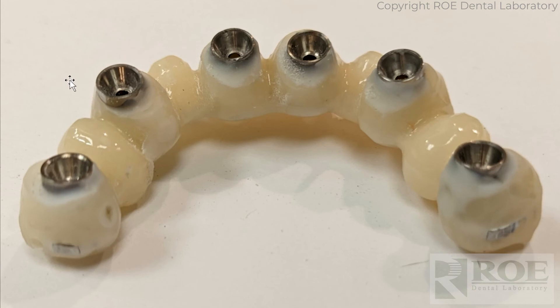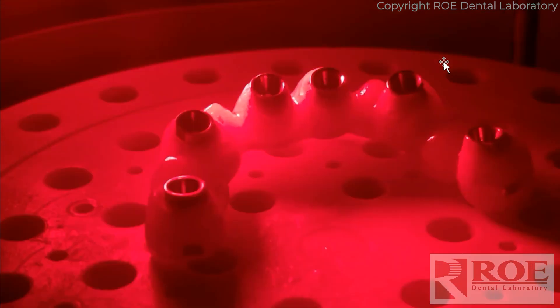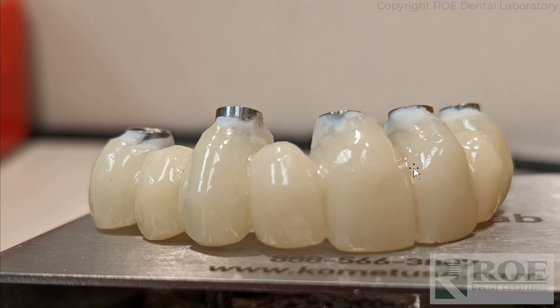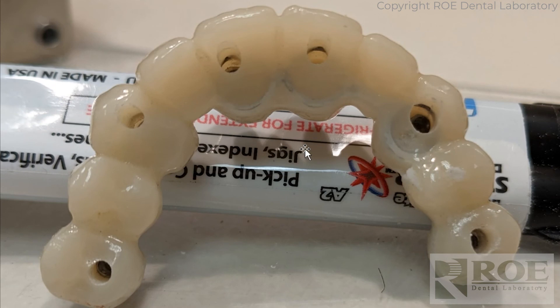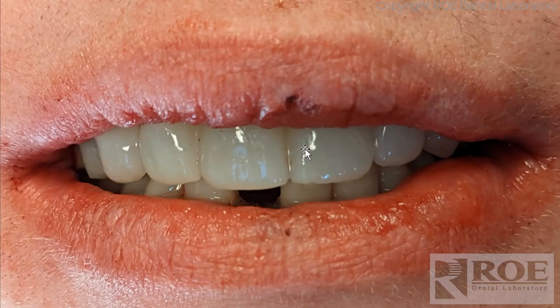Off the model — we've cut off the two cantilevers and the arms that go to the fixation base, and we're going to adjust it. In this case we used some glaze and put it in the light cure unit. The supports that come off the teeth, when you burr them off they're rough, so it's nice to be able to glaze and prepare it for delivery. It's a very nice looking restoration. Seven and ten were deficient in the mouth, so the doctor added some composite. Small holes, minimal lab work.